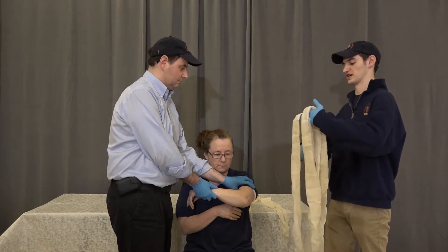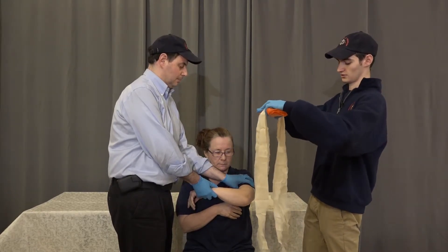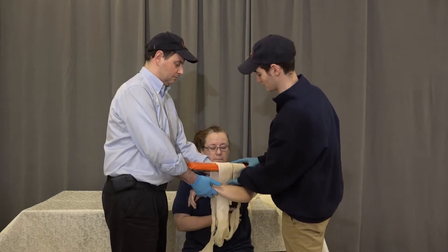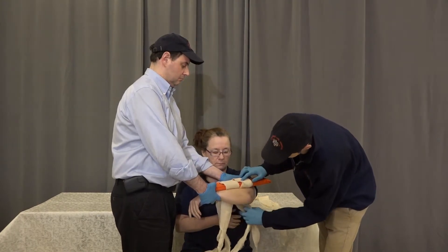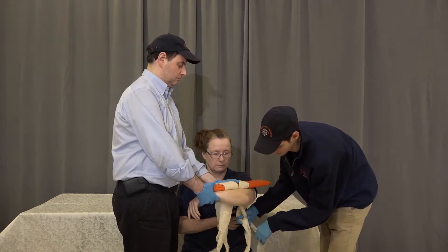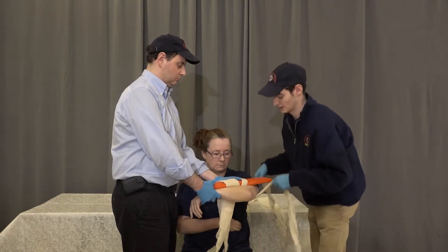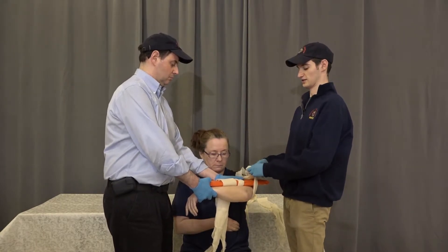We're going to go ahead and drape two cravats over the padded board splint. We're going to put those on the inside of the patient's arm, making an A on the elbow. We're going to start with the top cravat — twist it underneath, then come up and tie a surgeon's knot on top of the board.